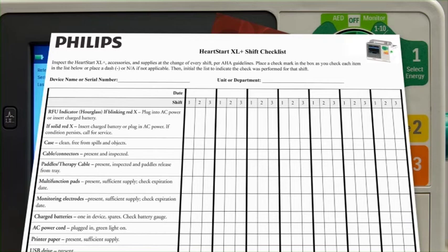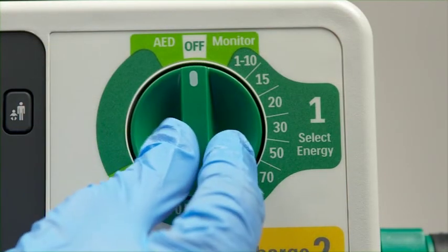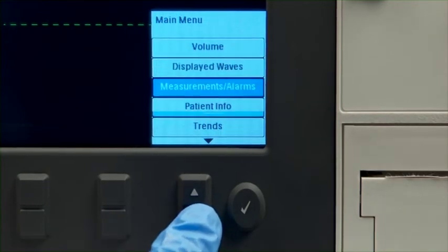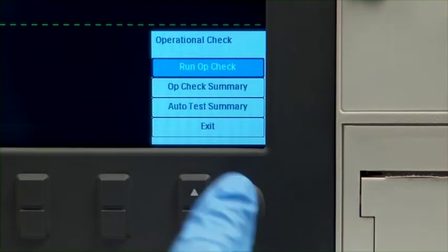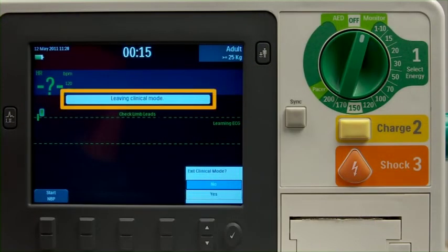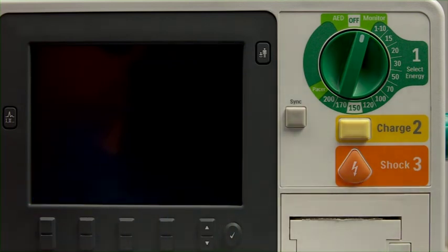You must make sure that the XL Plus is not connected to a patient when performing an operational check. To perform the operational check, turn the therapy knob to Monitor, then press the Menu Select button. Using the navigation buttons, select Other, Operational Check, Run Op Check, and press Menu Select. This message lets you know that you are exiting from all clinical functionality and entering a test mode. Select Yes to leave clinical mode, then press the Menu Select button to start the check.